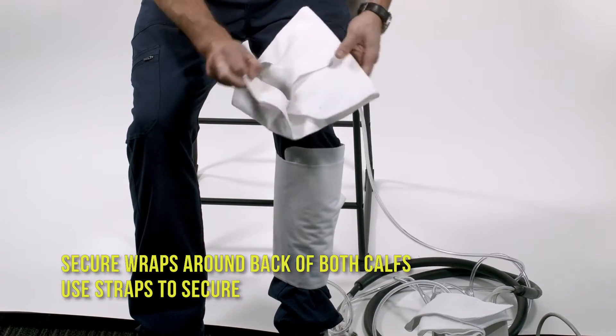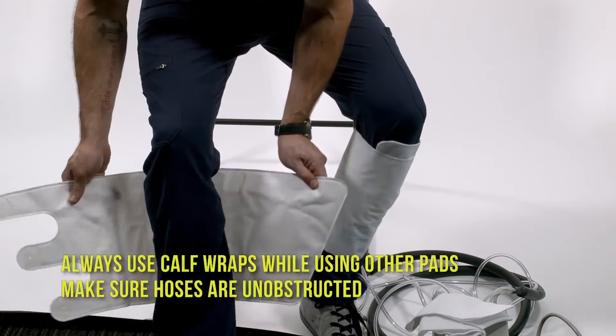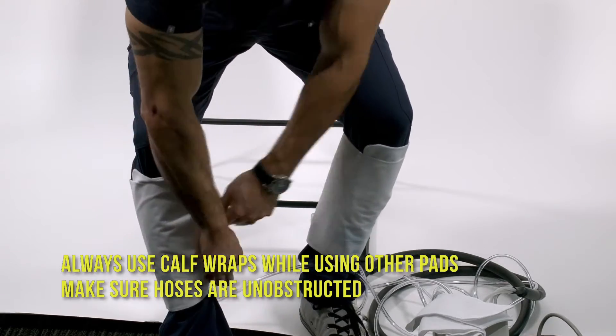Secure wraps around the back of both calves and use the straps to secure. Always use calf wraps while using other pads. Make sure the hoses are unobstructed.